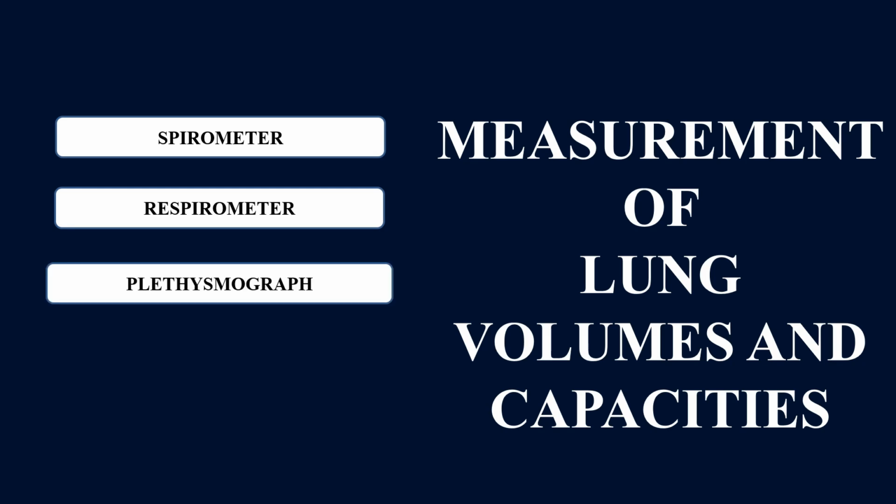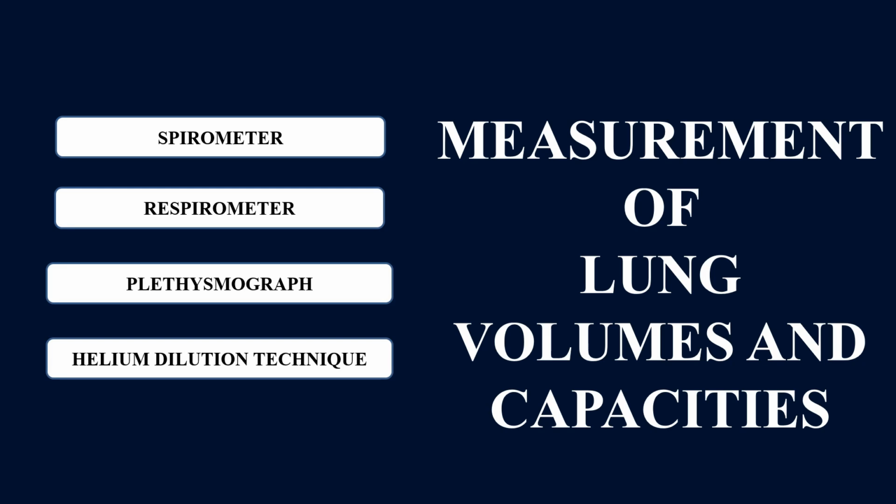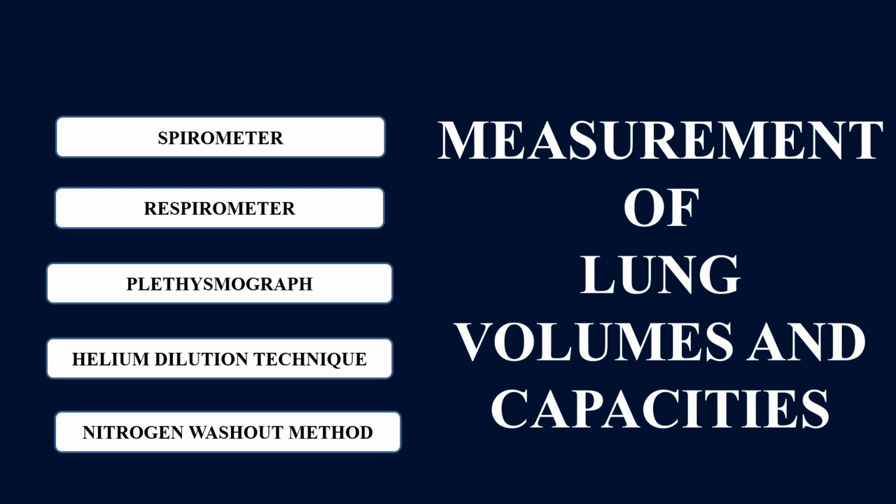These methods are plethysmography, the helium dilution technique, and the nitrogen washout method. These three methods also measure the residual volume and the functional residual capacity of the lungs.